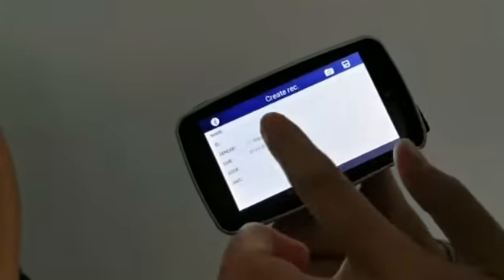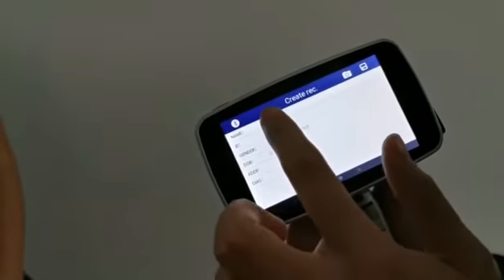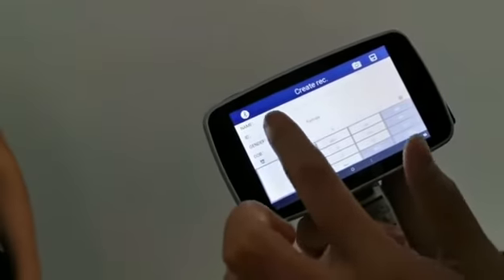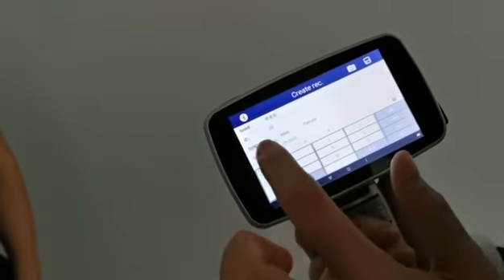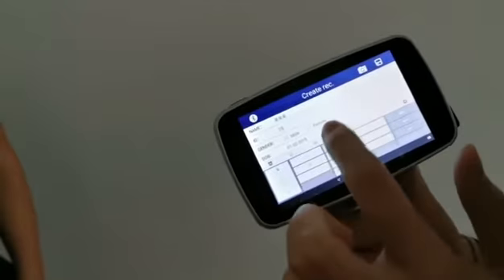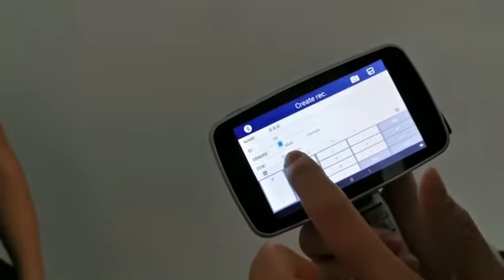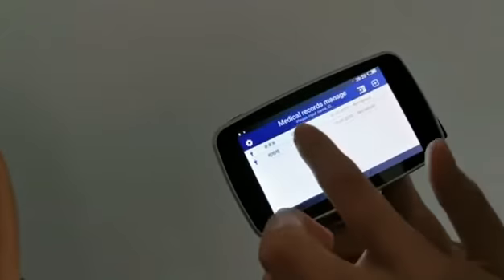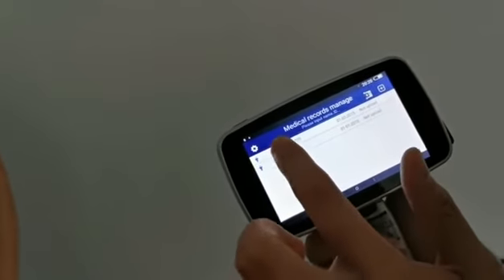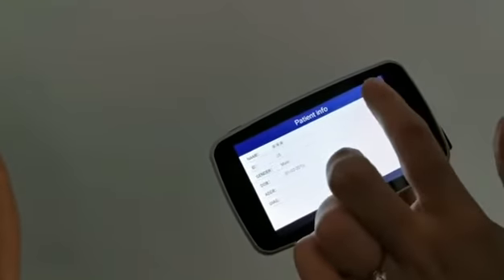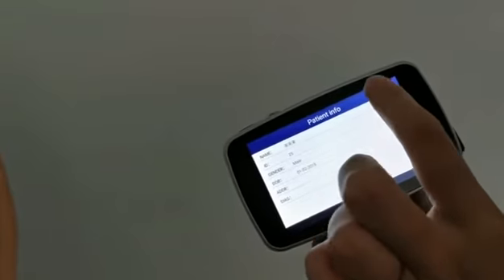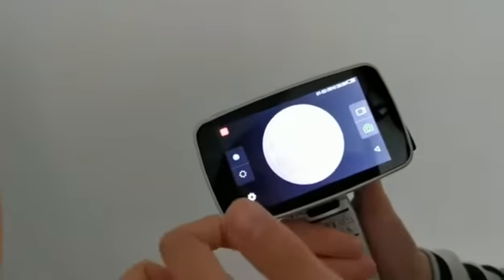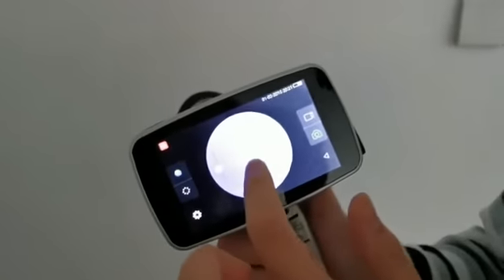Create the patient info: input the name, ID, and choose the gender and date of birth. Then save the record and enter. Here is a camera sign for this interface where you choose between these two.